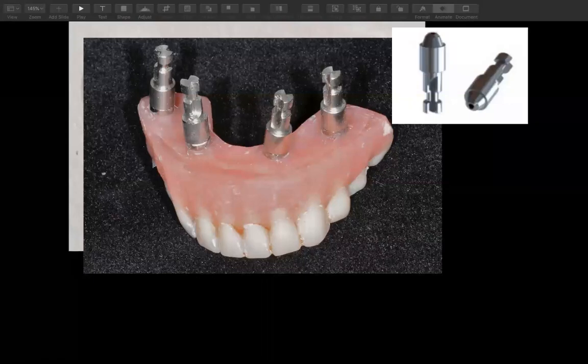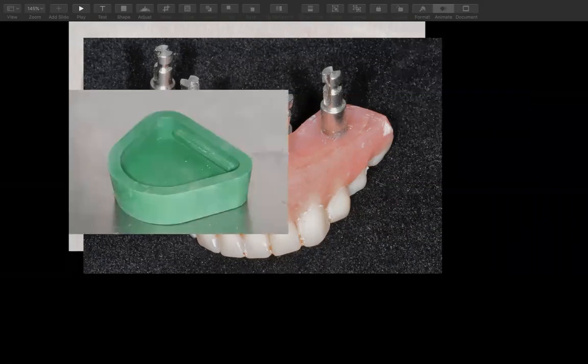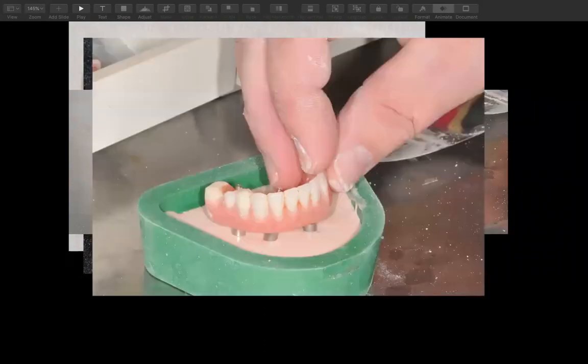So that's just part of the All-on-4 game. A lot of these temporaries can fracture or have issues, or teeth come out. It could be an occlusal issue for different reasons, but doctors want me to make some sort of a putty with analogs in the conversion, so they have something to go to. Then they can fix it in the office if there's an issue, or we can fix it in the lab without having to take an impression.